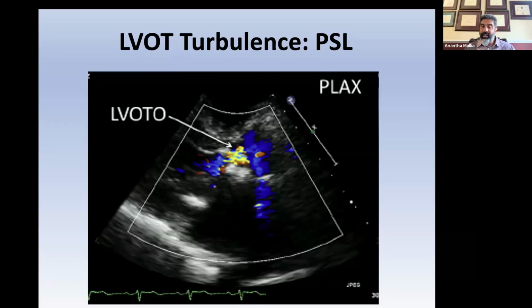One of the things that can do this, like I said, is obstruction here, either sudden narrowing caused by LVOT obstruction from HCM, or some sort of abnormal growth or vegetation, which can cause turbulence there as well. Or a hyperdynamic circulation, like in the setting of vasodilatory shock, pheochromocytoma, sympathomimetic drug toxicity, that kind of thing. That can also produce very high systolic velocities just because the heart is so hyperdynamic.